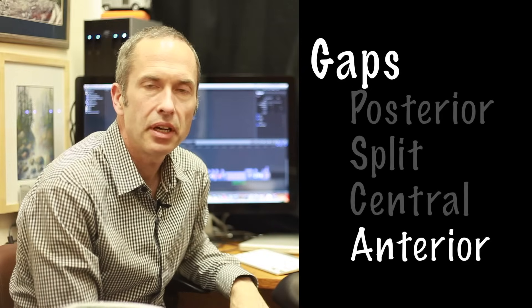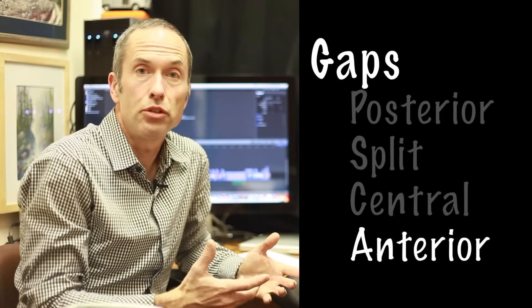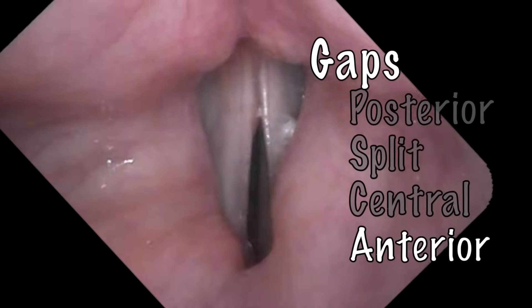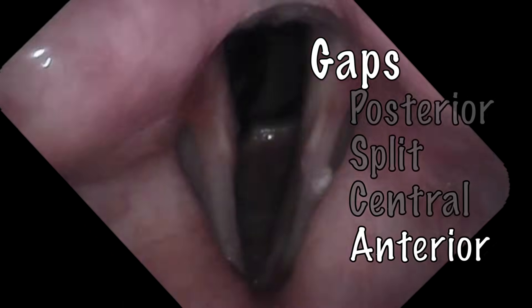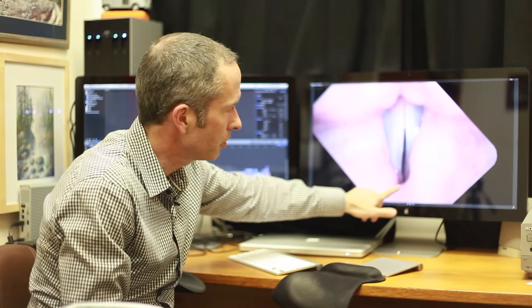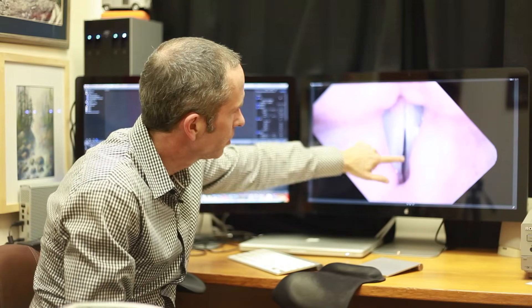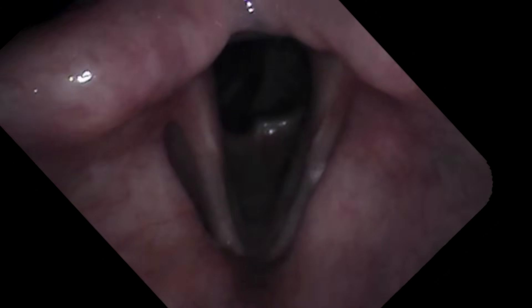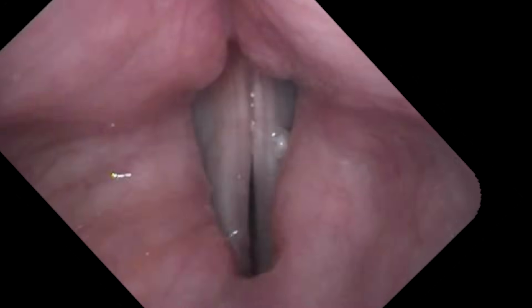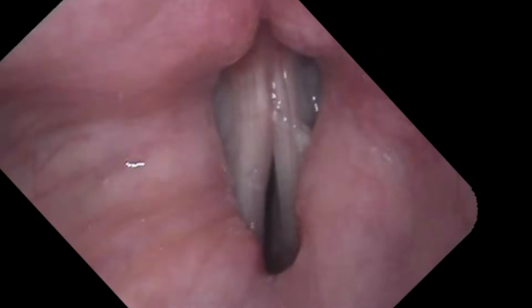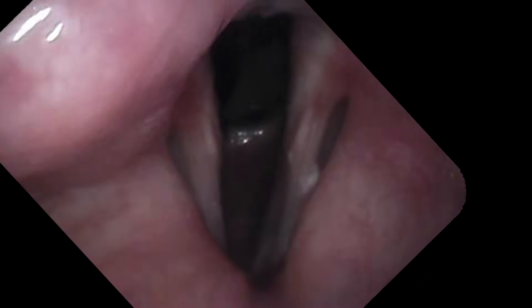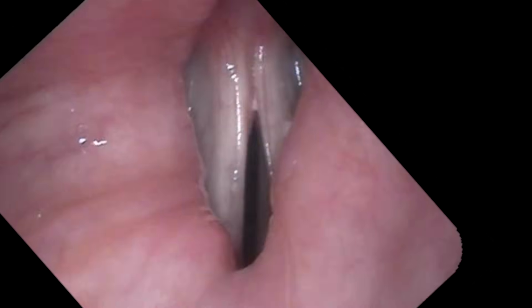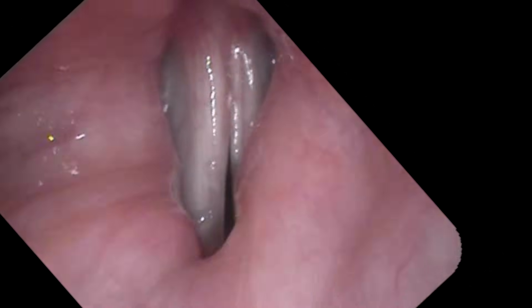We can also have anterior gaps — these are pretty unusual. This person had a surgery and the front of the vocal cords are no longer together, so even though he's able to bring the back together, we have a continuous air leak up front. And we hear that quality in the voice.